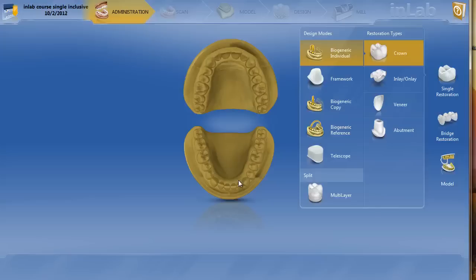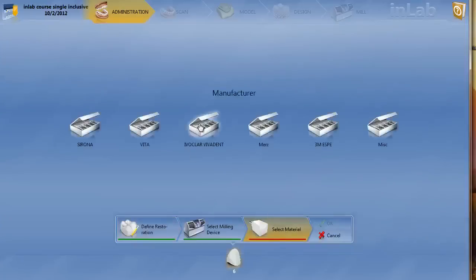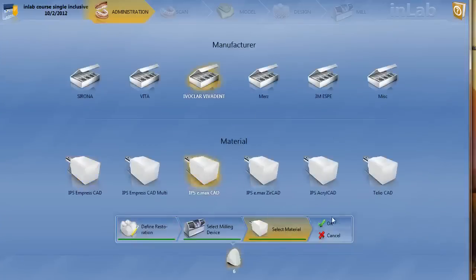In the administration phase, since you're not technically doing an abutment — you're using the Glidewell tie base — you don't designate it as an abutment. You simply designate it as a crown biogeneric. It's going to be on tooth number 6. We're going to choose our material, which is Emacs, and hit OK.